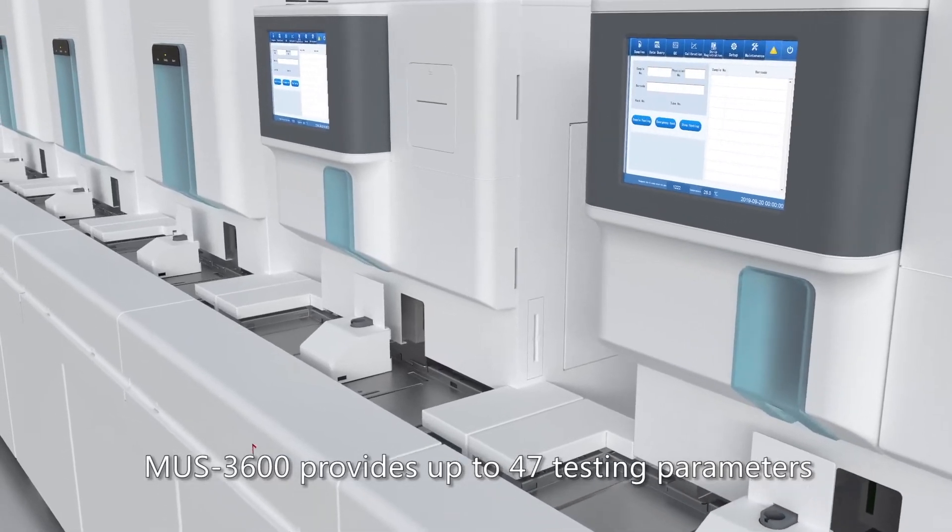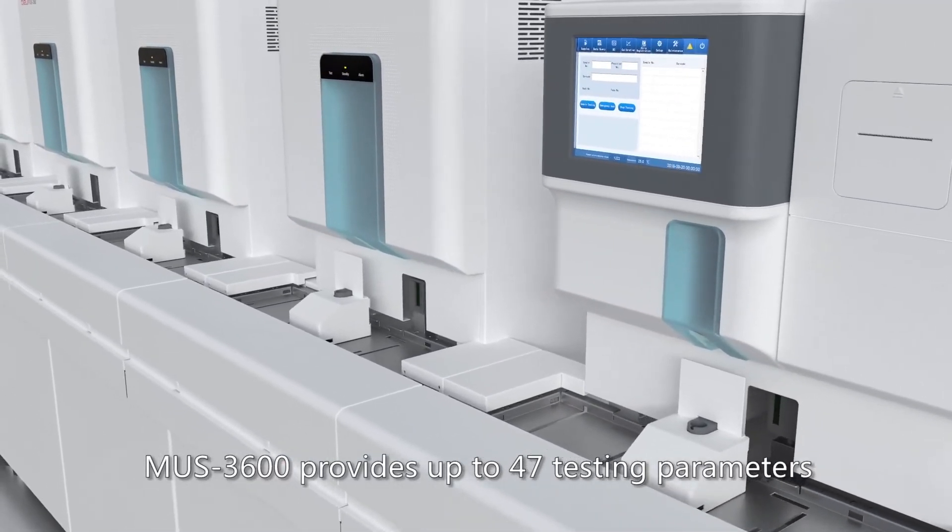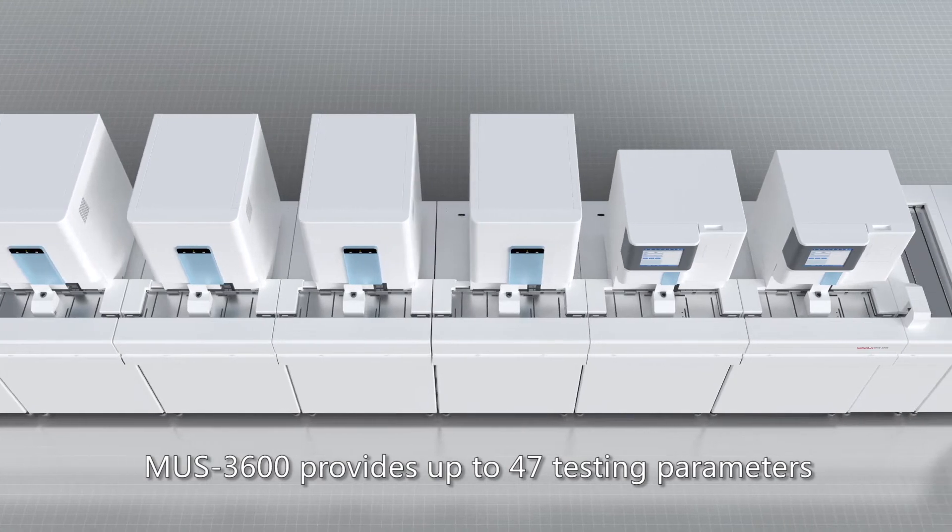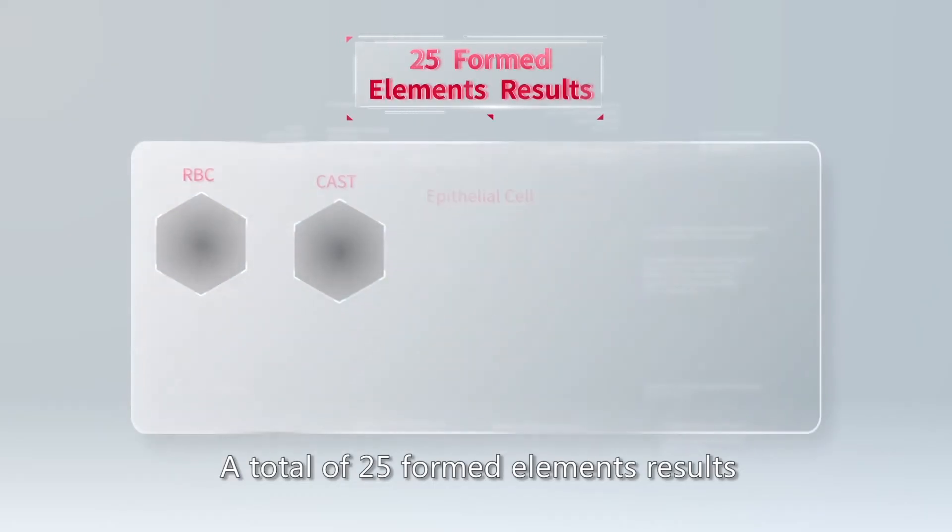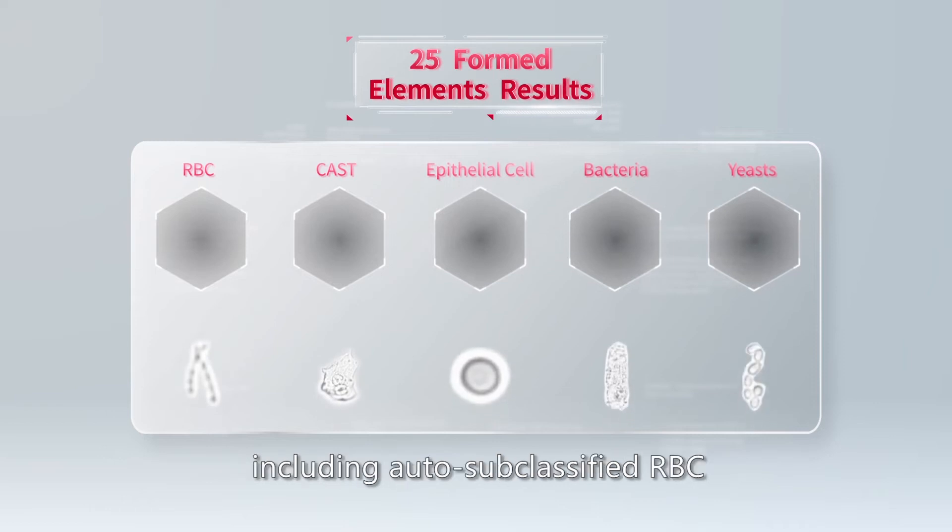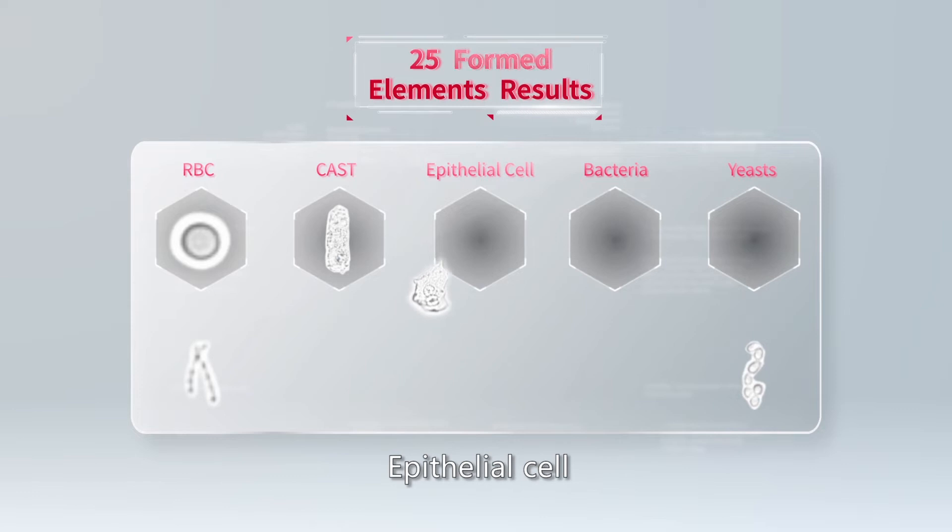MUS3600 provides up to 47 testing parameters for clearer clinical diagnosis, a total of 25 formed elements results, including auto-subclassified RBC, cast, and epithelial cell.